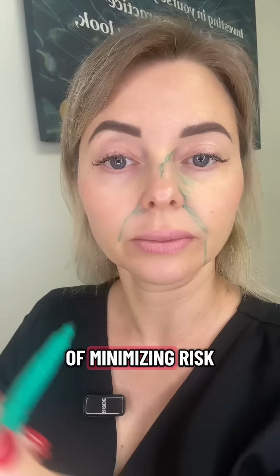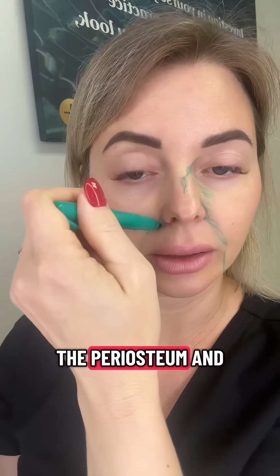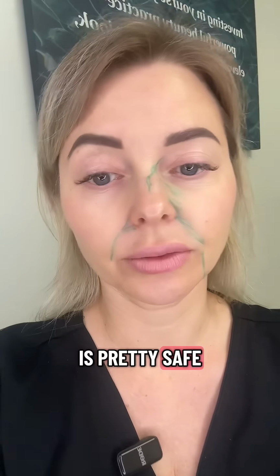The other two ways of minimizing risk: inject perpendicular to the skin, down deep to the periosteum, and create a deposit injection here. Because the angular artery will be going more superficial, that deep deposit is pretty safe to do.